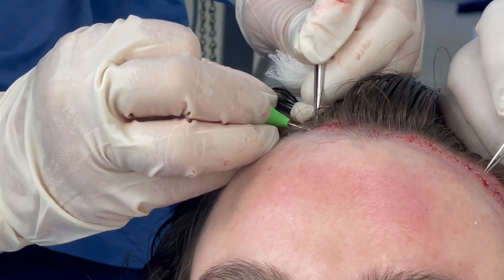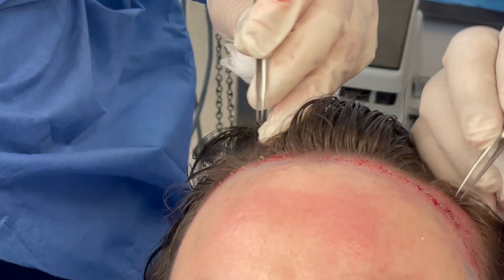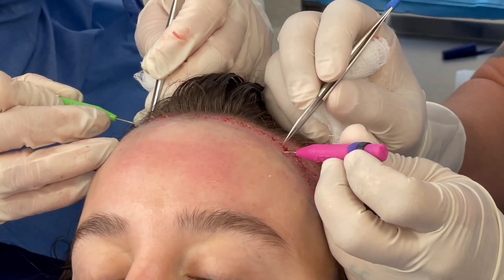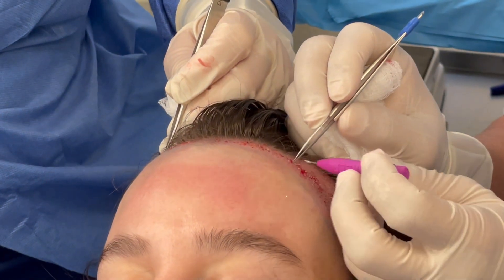In this way, we're able to implant quite rapidly — typically at least 600 to 800 grafts per hour at this rate. So this is the use of implanter pens.